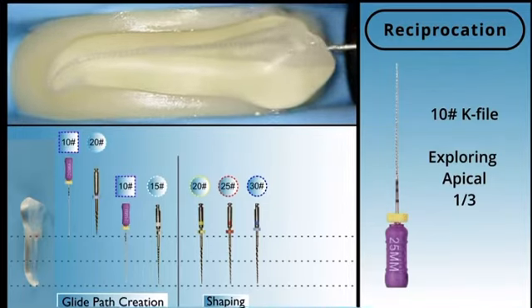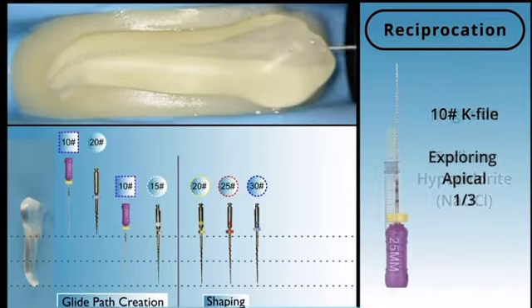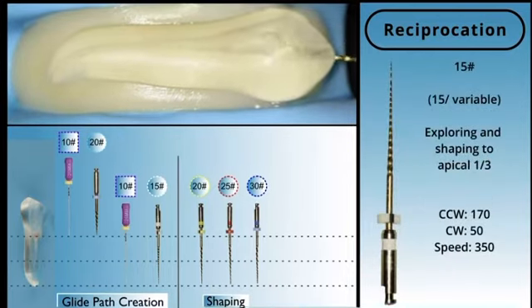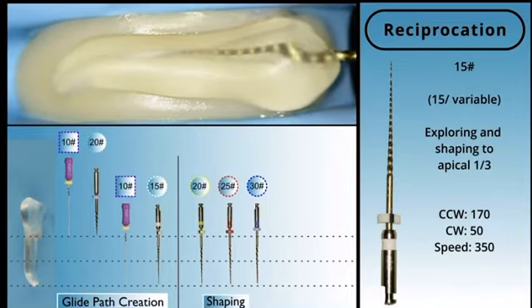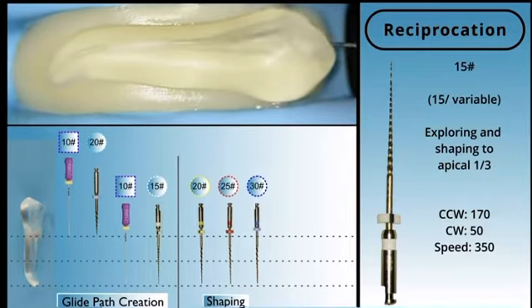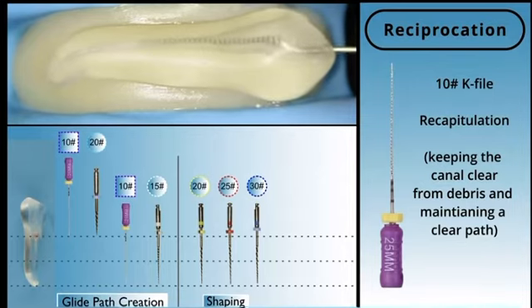So same again, we've opened up the canal orifice and now we're exploring the apical third with the size 10K file. Lots of irrigation. Using the size 15 glide path file, again, works pretty well in reciprocation. And using the size 10 file for recapitulation, keeping that canal space patent.